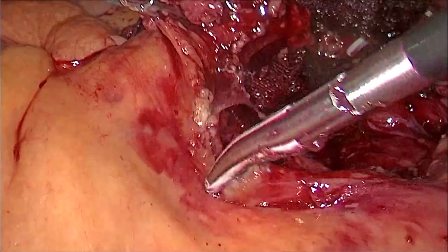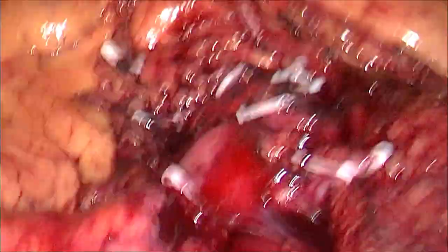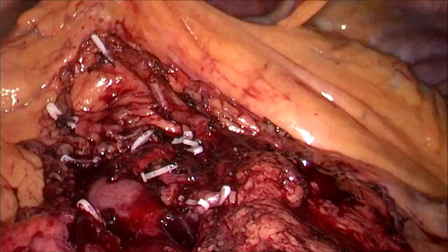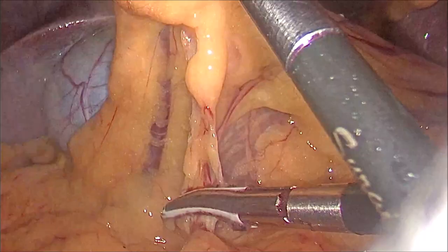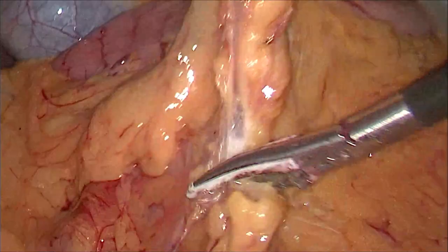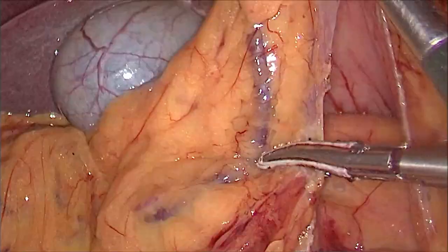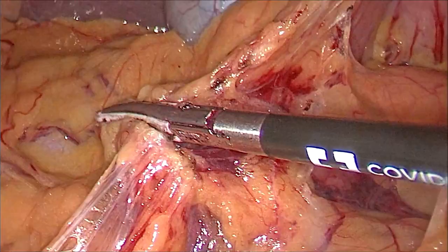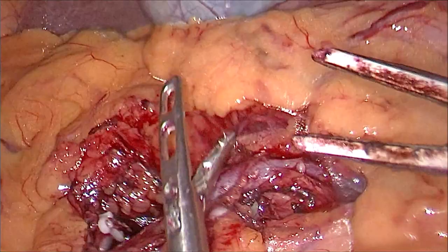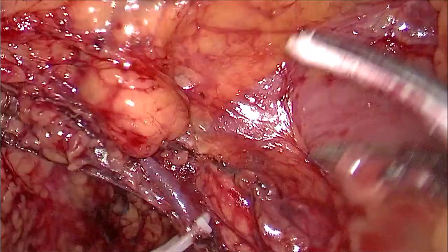The mesentery is also taken down towards the ileum to enable extraction of the specimen through a small peri-umbilical incision after applying a wound protector. The camera is then shifted from the suprapubic port to the umbilical port to take down the gastrocolic ligament. The right gastroepiploic vein is identified, and lymph nodes along it as it enters the gastrocolic trunk are also taken down. A clip is applied below on the gastrocolic trunk.